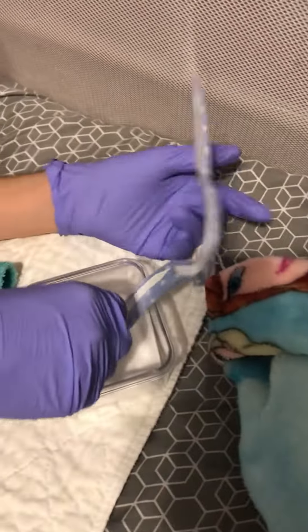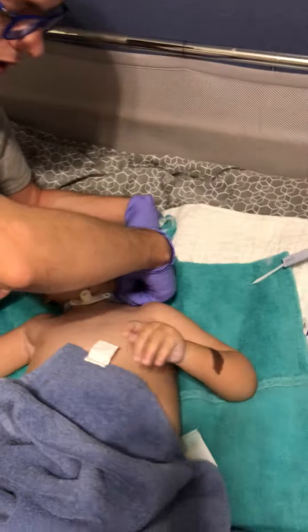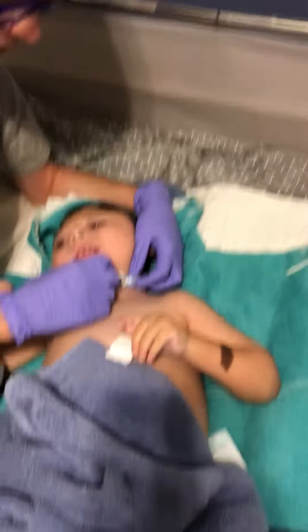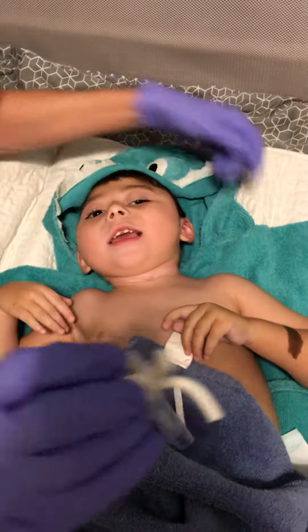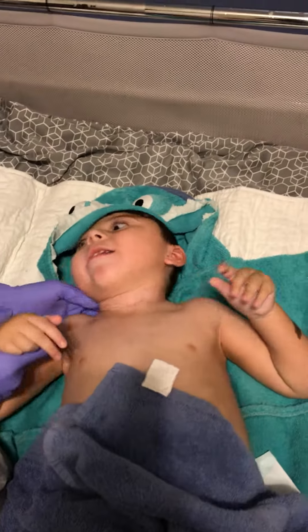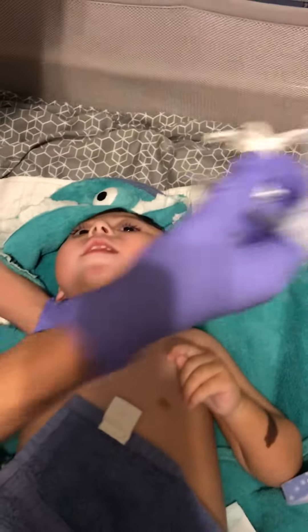Get that on there and then we'll take off the old trach ties. Now people get nervous right here, but we have to remember that his trach's been in for a while, so his stoma is good and healed. We have plenty of time, no need to rush.